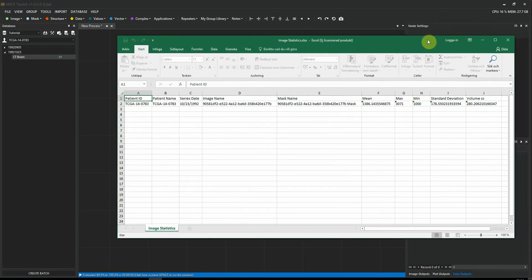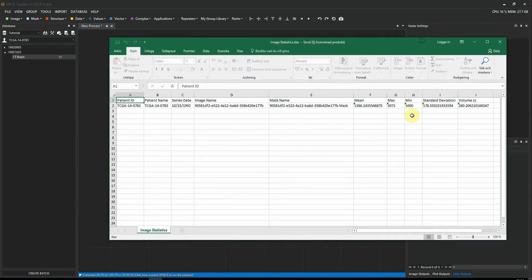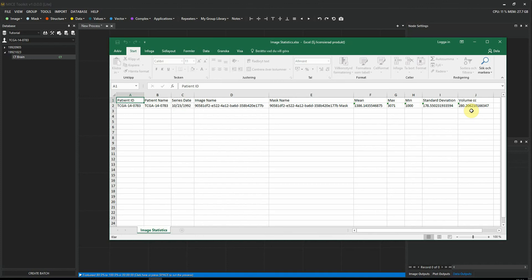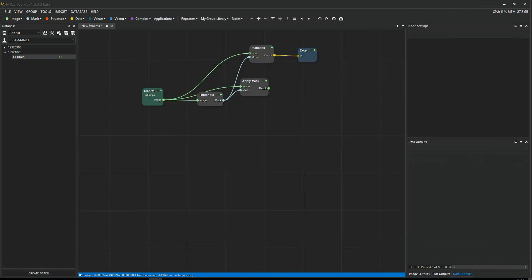And this is the Excel sheet that we just saved. So first, we have some patient information and metadata. And after that, we have this statistical information that we chose to calculate. And this is just how easy it is to generate a mask from an image and then get some statistics from that mask.